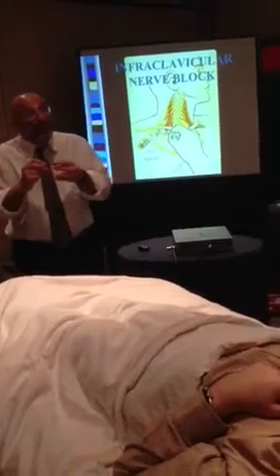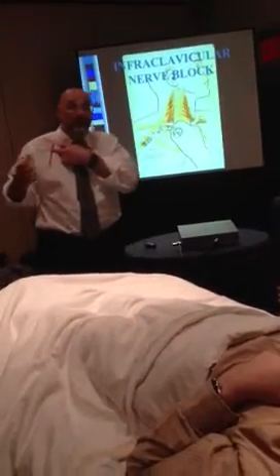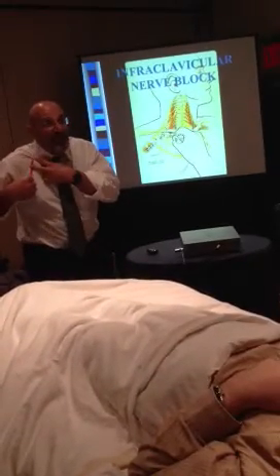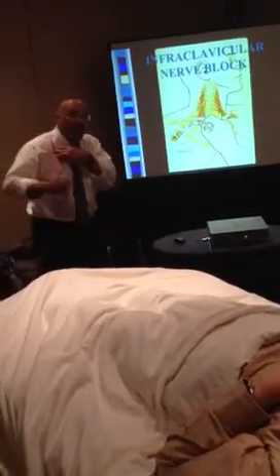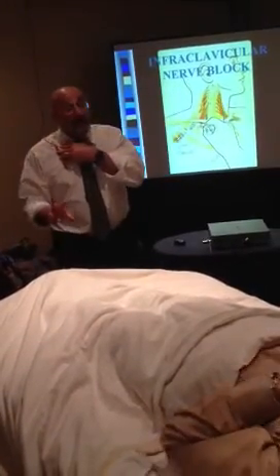Now, my insertion site direction endpoint. It never changes. My insertion site is 1 inch down, 2.5 centimeters for those of you who insist on talking metric, but 1 inch down from the midpoint of the clavicle. You ready? Perpendicular to the clavicle. Never, never, never, never drop that line along what I call the plane of the patient, because that brings you what? To medial.